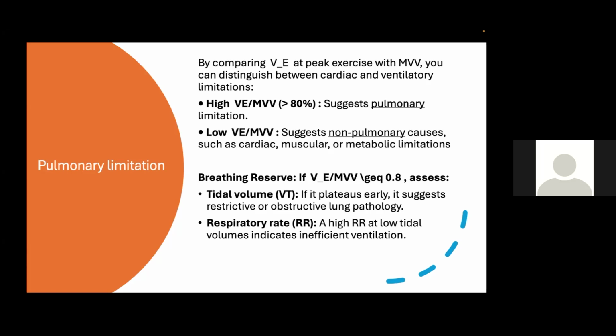So to look for the tidal volume and respiratory rate. If the tidal volume plateaus early, that suggests restrictive or obstructive lung pathology. Also, if there is a high respiratory rate at low tidal volume, that indicates inefficient ventilation.